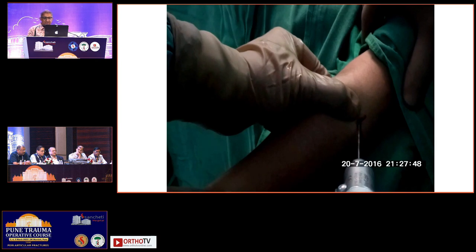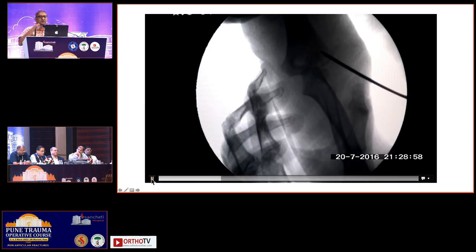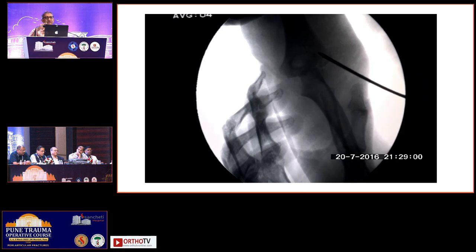That is the sequence. And this K-wire, you are going through the lateral condyle without drilling through the cartilage. And then you start drilling. That is how it is done. And this is how it's showing on the C-arm. First, you push and then you drill.